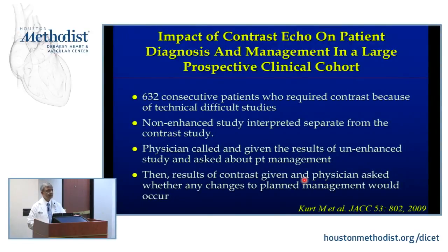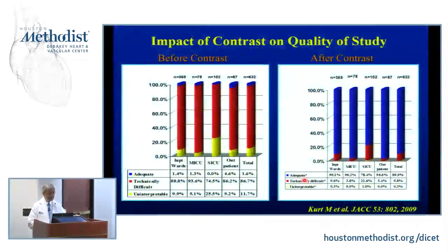So what we did is actually, he would call them with the results of the non-contrast study and we'd give them the information. If you can estimate an EF, you give them an A. If I can't estimate an EF. And the physician decided on whatever it is. Then he said, Dr. So-and-so, actually, this patient got contrast, and actually the images are like this. What do you want to do now? Okay, so that's what we did, and actually you'll see what the impact is going to be.